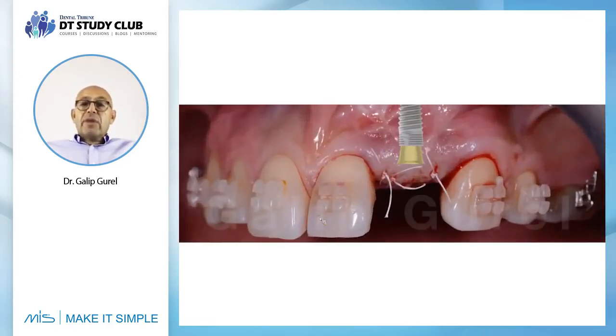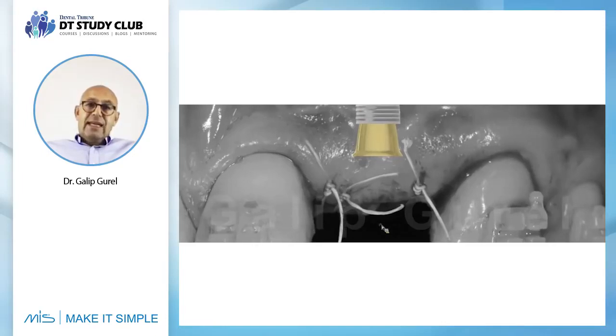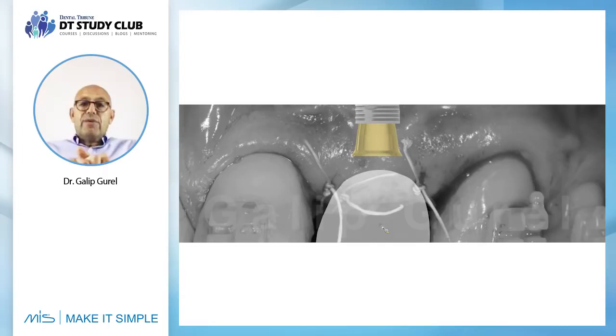First of all, once it's screwed in, tightened over the implant, it creates a platform switch immediately in that zone. This is the first advantage of that. And when we get closer and relate it to the final shape of the crown we'll be placing here, the head of the implant to the gingival zenith of the tooth should be approximately 3 millimeters.